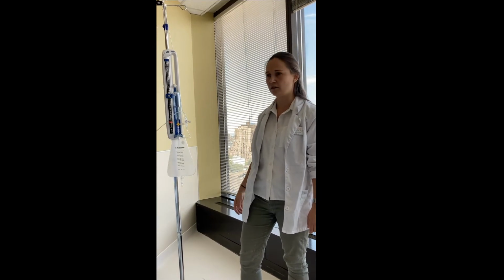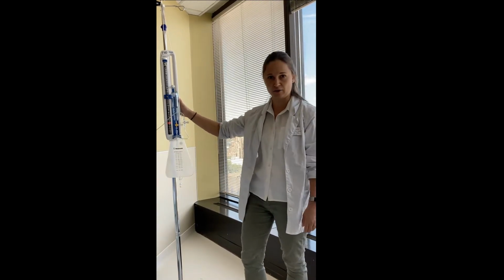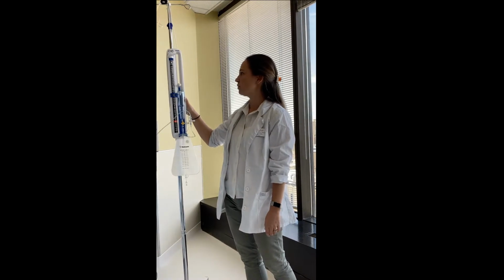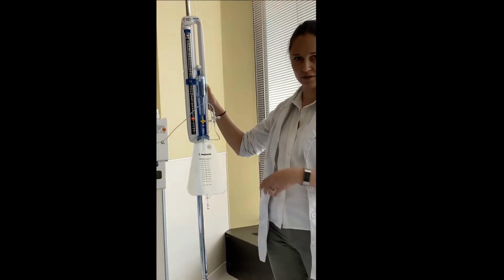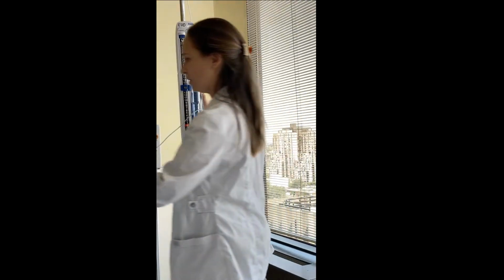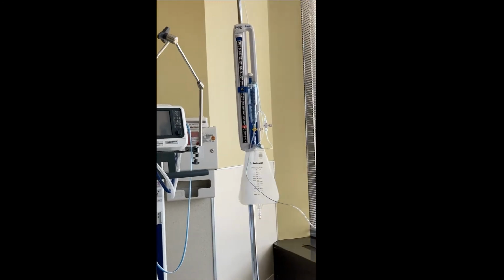Just as a reminder, the cerebral spinal fluid circulates in the ventricles as well as in the subarachnoid space in the brain. So this system is the external ventricular drainage system, and an external ventricular drain attaches to an actual drain that is in the head of the patient, usually sitting in either a lateral or a third ventricle in the brain.